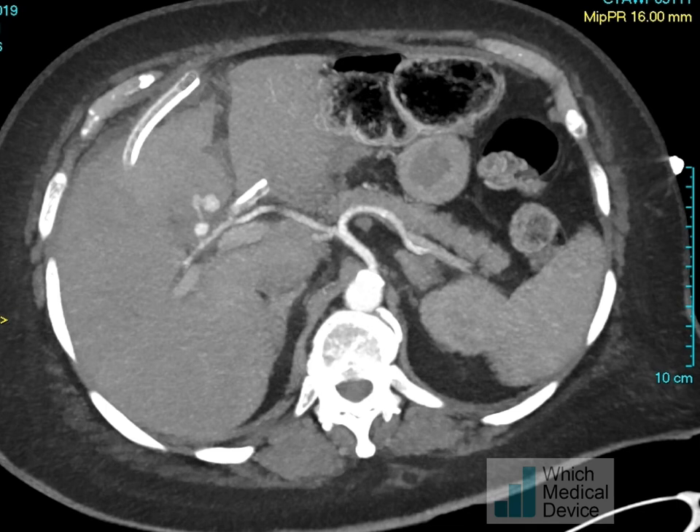This patient had a complicated laparoscopic cholecystectomy performed in another hospital and was transferred to us with bleeding from their intra-abdominal drains. You can see this trilobed pseudoaneurysm which is arising from the right hepatic artery on the CT scan.